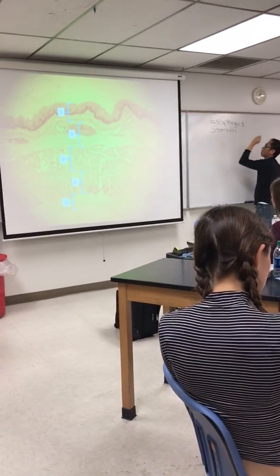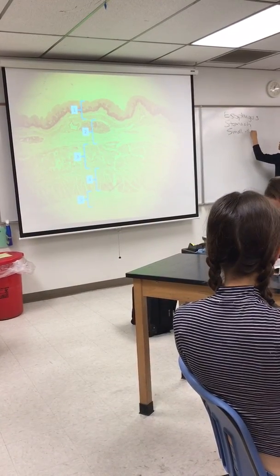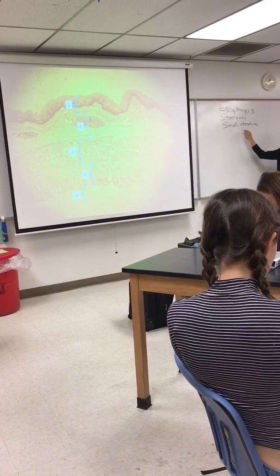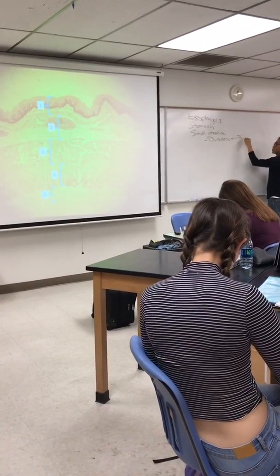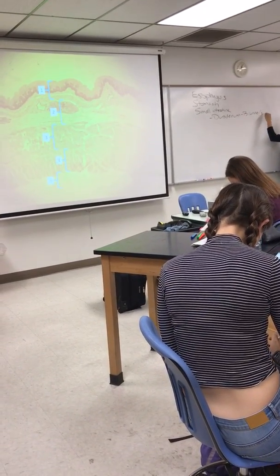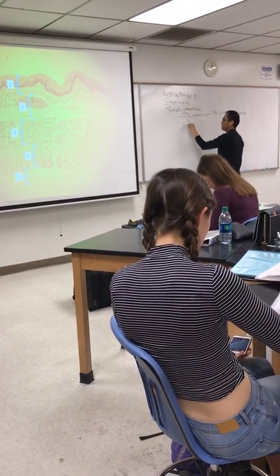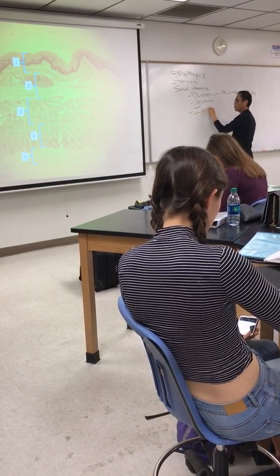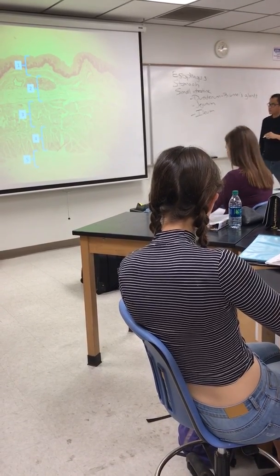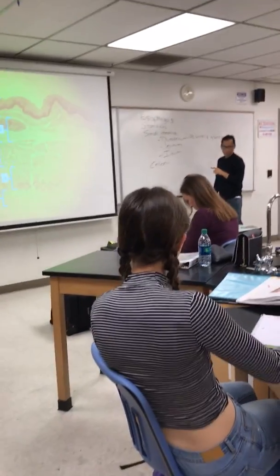Stomach, then small intestine. You should be able to identify if you're in duodenum, because you should be able to identify Brunner's glands. And then there's also jejunum and ileum. And I'll give you clues to identify those other two. And then we'll talk about colon. Something I really focus on in colon are the importance of goblet cells.